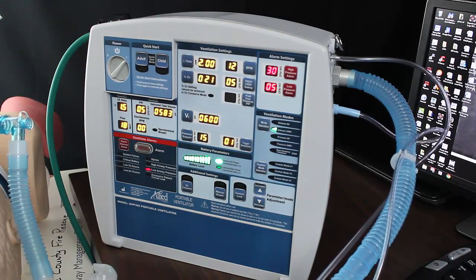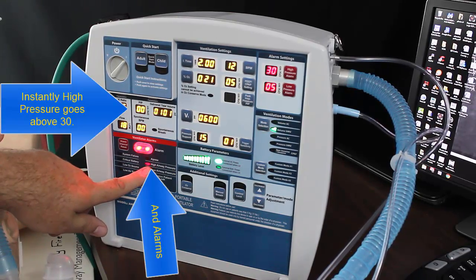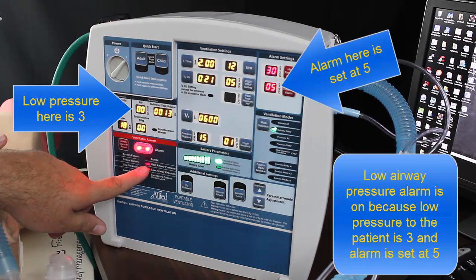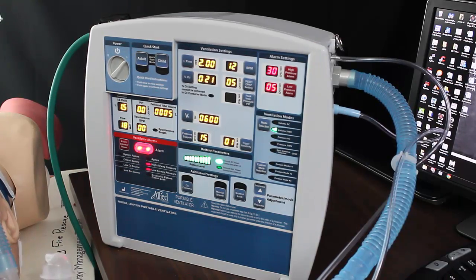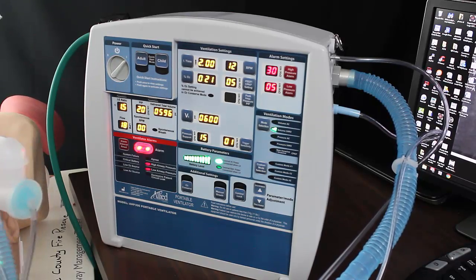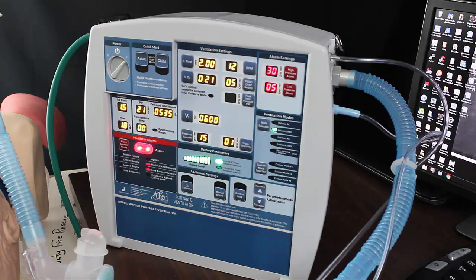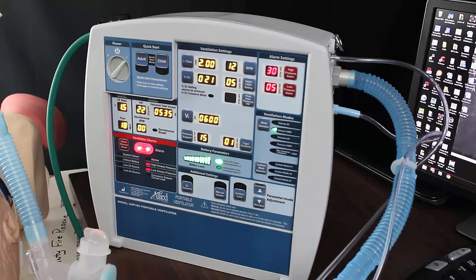Now let's say I kink my tube. I instantly got a high airway pressure alarm and a low airway pressure alarm. When something goes wrong with your equipment and you cannot immediately identify it, you are going to disconnect and use a BVM to breathe for the patient, troubleshoot your equipment — but you are going to help the patient first. Get them oxygen, and then try to get them back on track with their hospital settings.